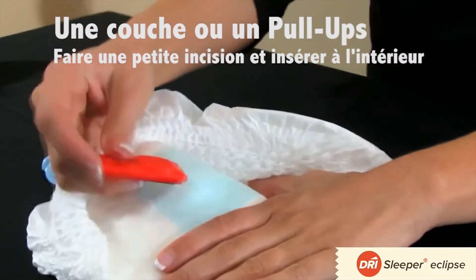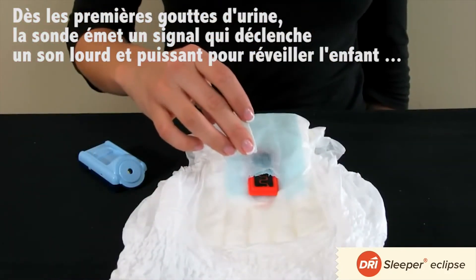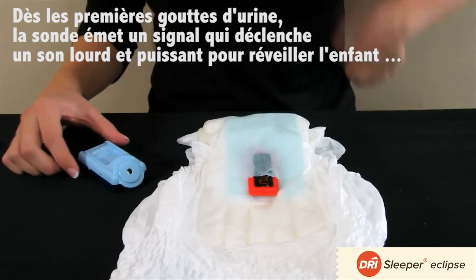Simply cut a slit and slide the Euro sensor into place. When the sensor detects urine, the receiver emits a loud chirping sound alerting you and your child.